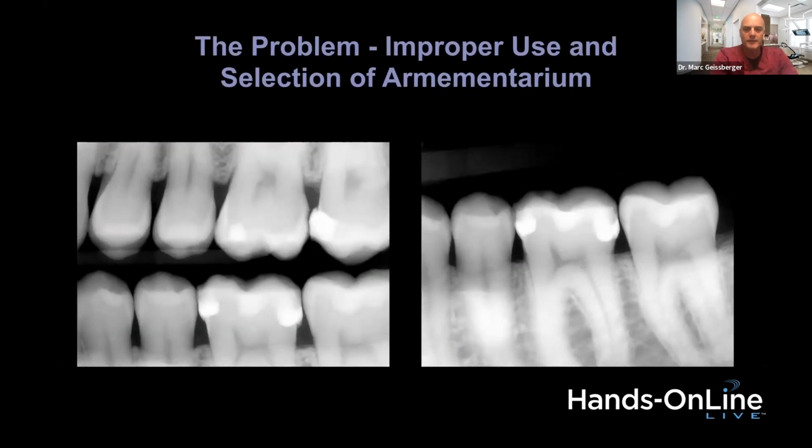Now, what I see too often is this type of dentistry. This type of dentistry leaves a lot to be desired, but if you look, there have been Class 2s done on the lower first molar and upper second molar. When I look at that upper second molar, I notice that ding in the adjacent tooth. That is not incipient caries, but rather iatrogenic damage to the adjacent tooth while preparing that MO on the upper second molar. You'll also notice that the teeth have grossly been over-contoured cervically, and they actually lack a proximal contact in an ideal situation.